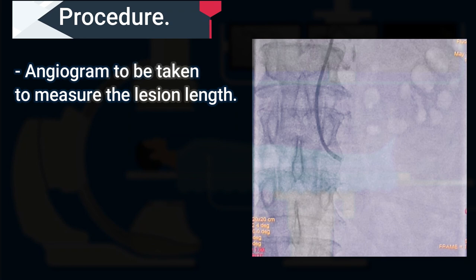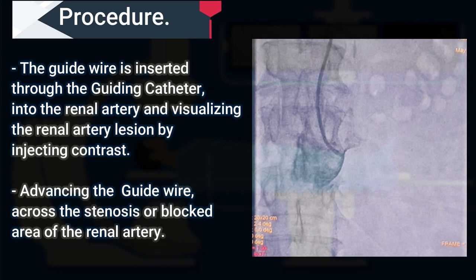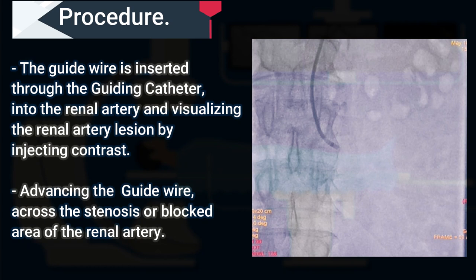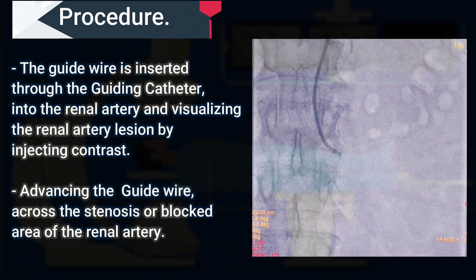After positioning the catheter, an angiogram is taken to measure the lesion length. Then the guide wire is inserted through the guiding catheter into the renal artery, visualizing the renal artery lesion by injecting contrast. After that, the guide wire is advanced across the stenosis or blocked area of the renal artery.